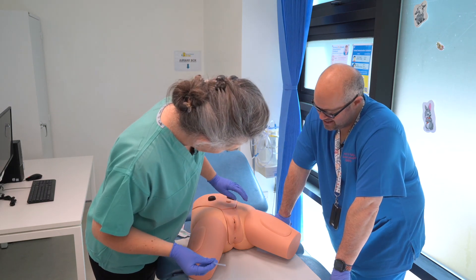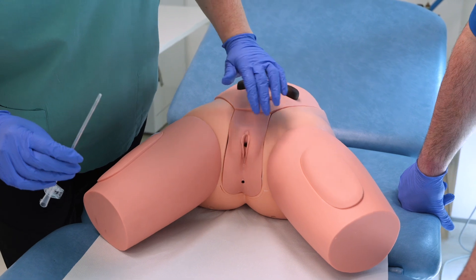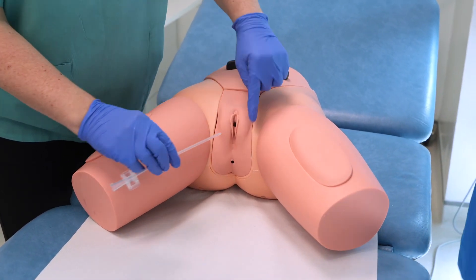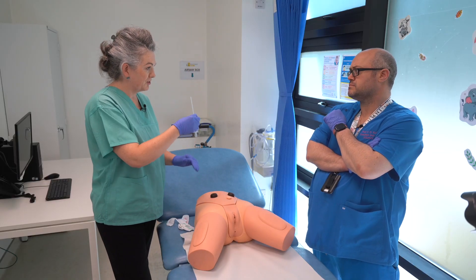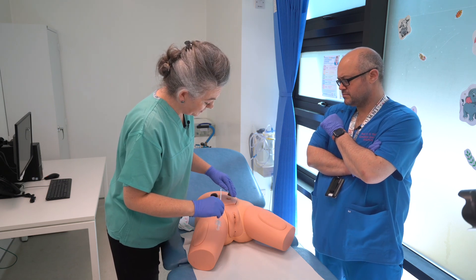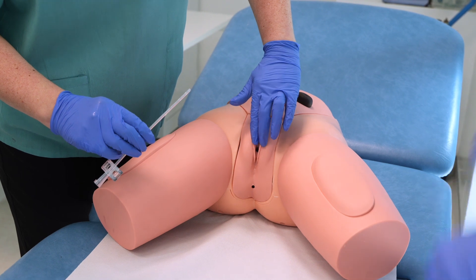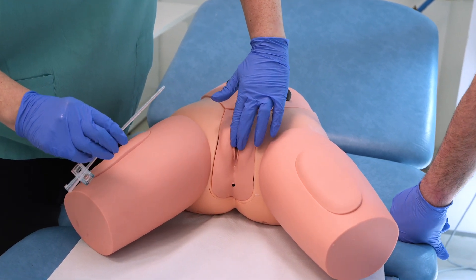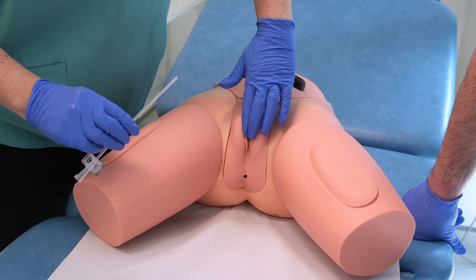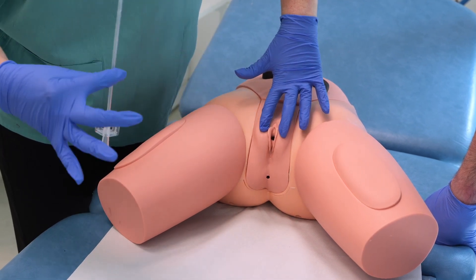Finding the urethra is your golden ticket. Give a little clean so the area is nice and clean, then separate the labia — that's the biggest step. You don't want to come through closed labia into the urethra because you'll carry bacteria from the skin up into the urethra, putting you at risk of a urinary tract infection or bladder infection. With two fingers, very gently as close as possible to the inner labia, gently open and lift.